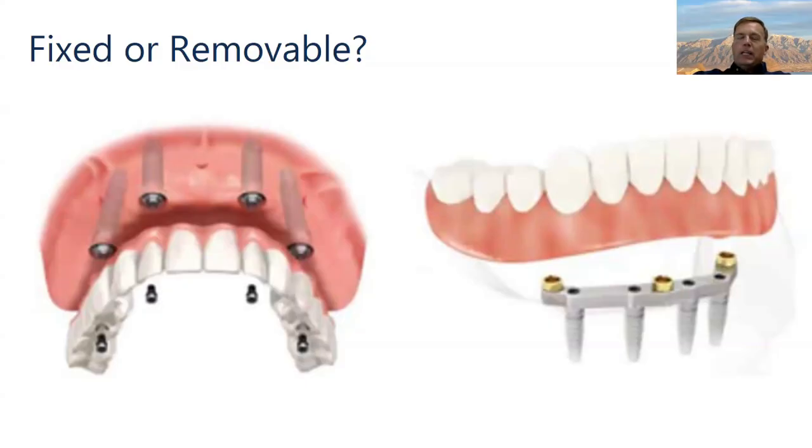So your patients may be more interested in a removable restoration than you might think. Now, in the past, we kind of had to decide between, well, fixed or sturdy and stable, and removables move a little bit, but we'll talk at the end about different prosthetic options. We now have removable options that can be just as sturdy. So that can be a factor.